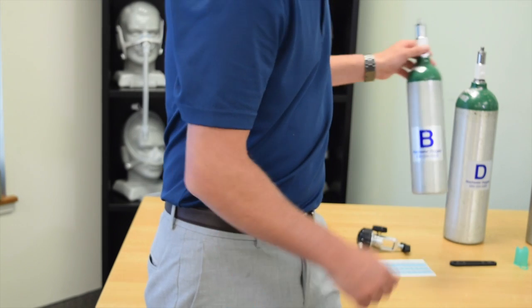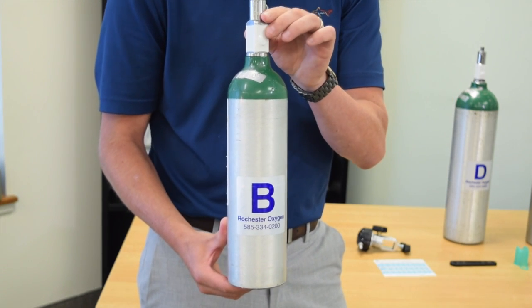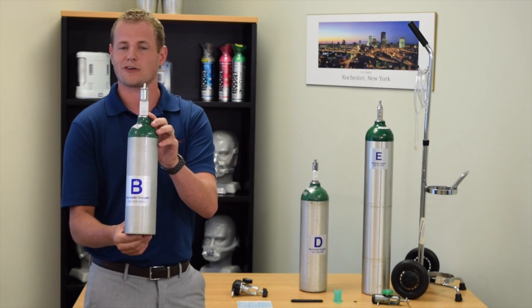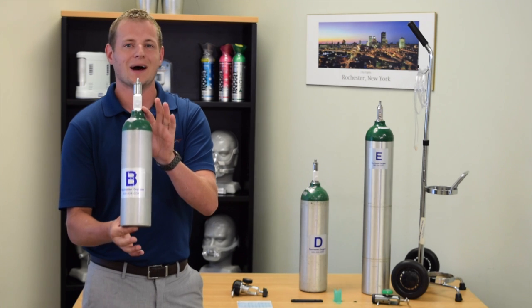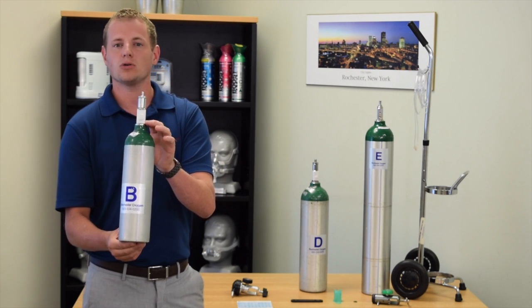The smallest tank is the B tank. This tank weighs in at about three and a half pounds and can run approximately four to six hours on a flow of two liters, but it requires a conserving device to use, which is a pulsed system.